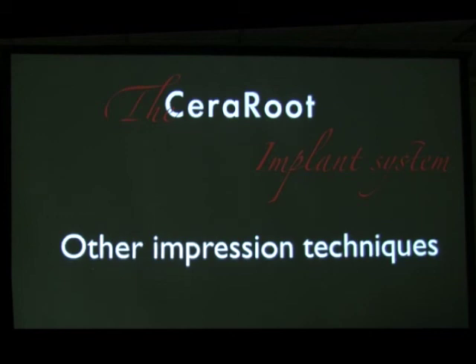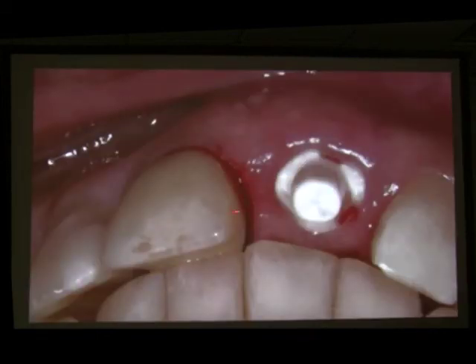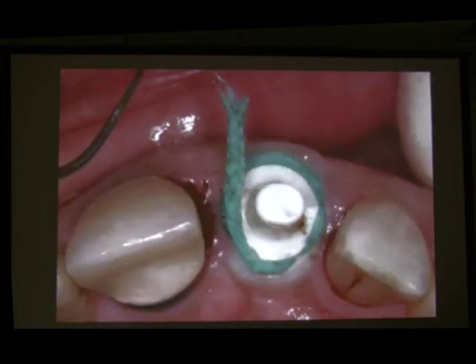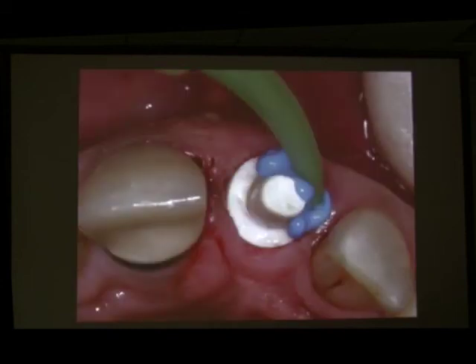situation. Other impression techniques. We have seen impressions with the coping, but in extremely simple cases like this, where the implant is almost visible, a small soft retraction cord can be used without too much force, and it goes perfectly. You can scan or take impressions conventionally even without a coping, because if the lab receives an impression with this type of situation, they don't even have to know that this is an implant. You can just tell them this is a tooth, put a crown on top of this abutment that I have prepped. I'm a very good restorative dentist, and I have prepped this tooth amazingly. So, conventional direct impressions without coping.